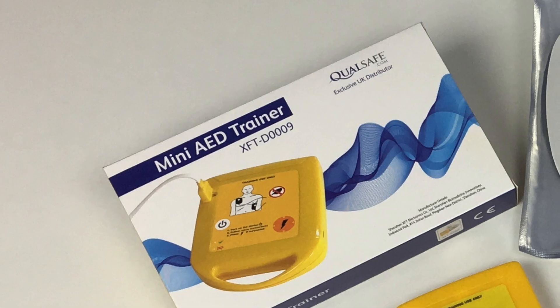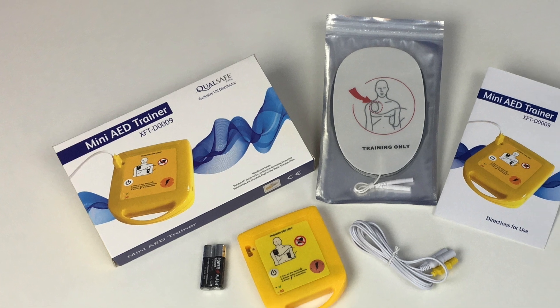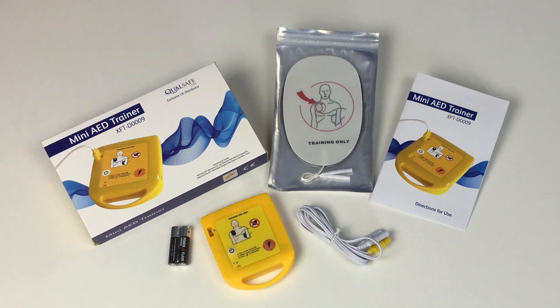The unit accurately simulates defibrillation without administering a live shock, so it's completely safe for use in the classroom. The Mini AED Trainer comes packaged with two alkaline AAA batteries, connection leads, training pads and instructions.